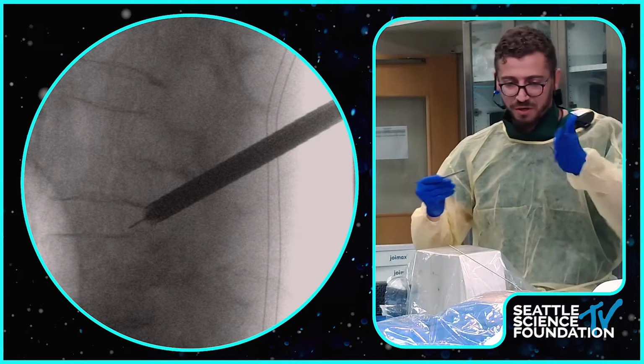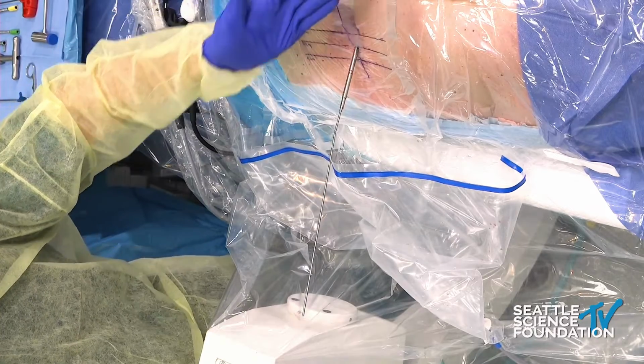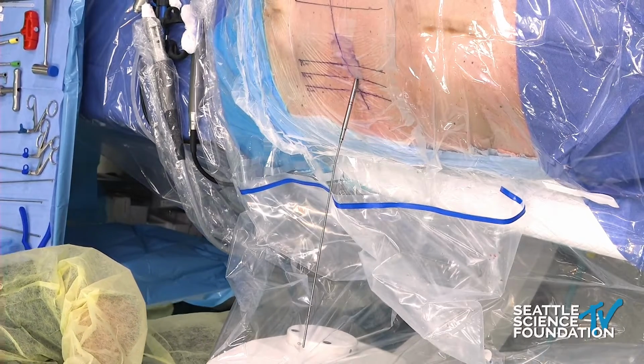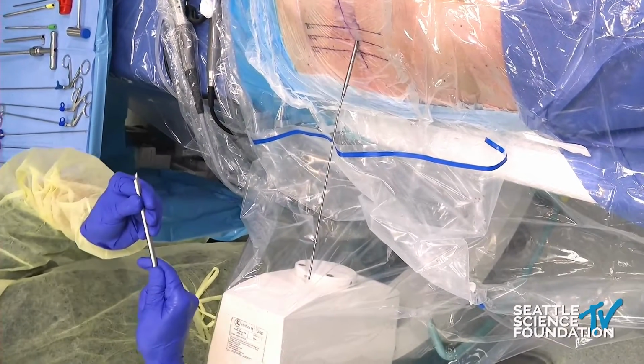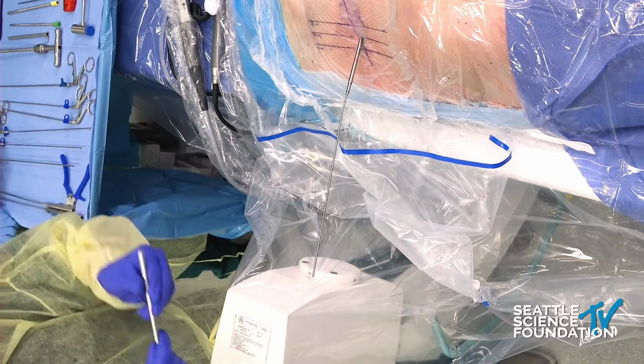As you're going in, there are multiple ways of doing it. In this situation, you have your traversing route like this, and your exiting route like that. You want the opening open to the traversing route or the exiting route so that you don't cross it as you're going in. Then you slide on the epidural space, and you open up to look into where the SAP and the pedicle is.